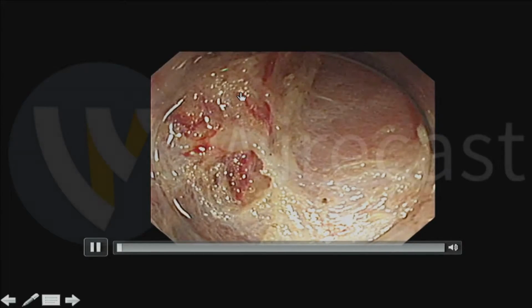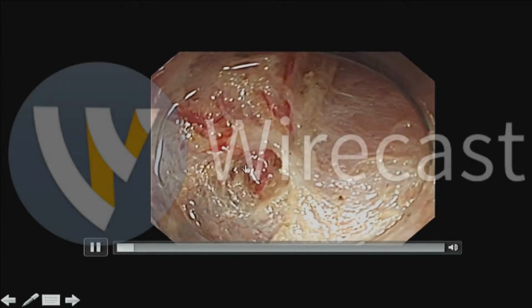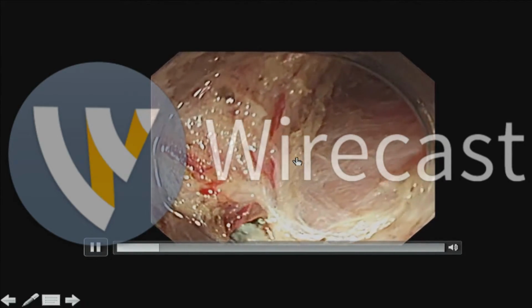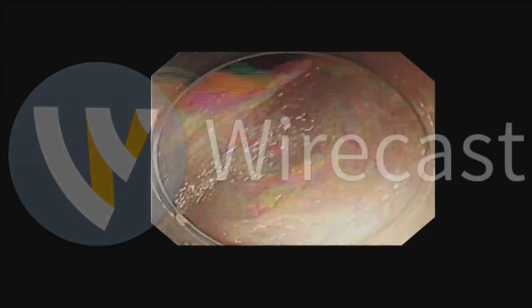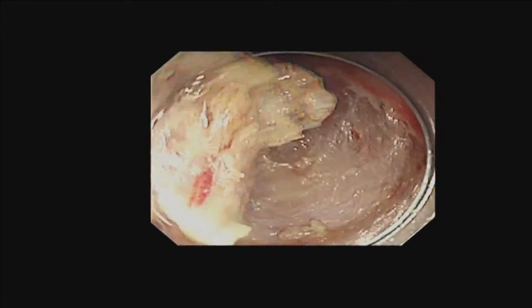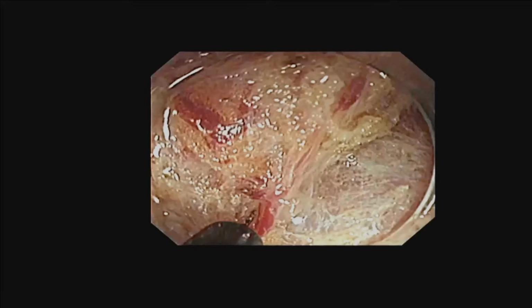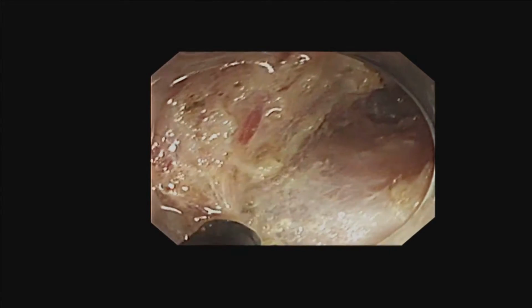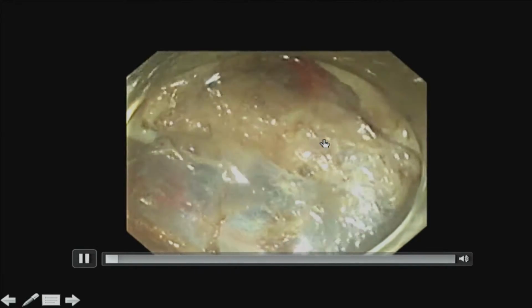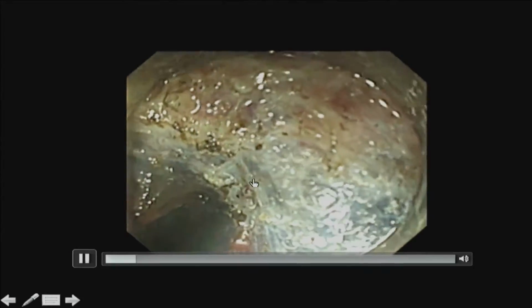This is also the same. This vessel is surrounded by the submucosa with a lot of fat contents like this. Please be careful of the fat. Isolate the vessel with the hook knife like this. After that, catch up the vessel a little bit and spray coagulation like this. The other thing is, I already coagulated with the knife and am cutting again.